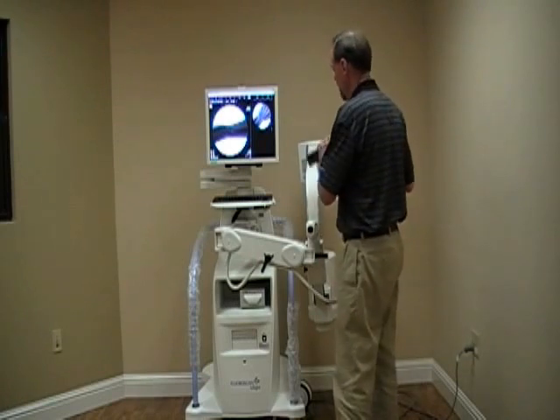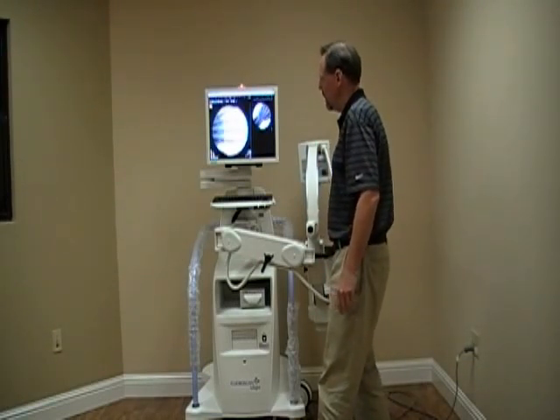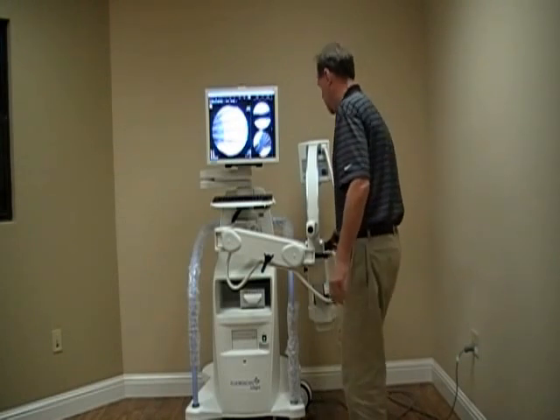The system will go from AP to lateral and give us a nice picture. We're going to go over a finger, holding the foot pedal. It's going to measure the tissue density and give us everything we want in that manner.